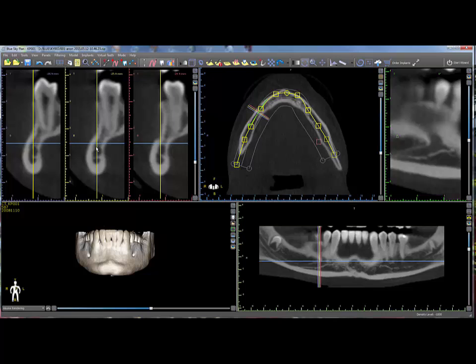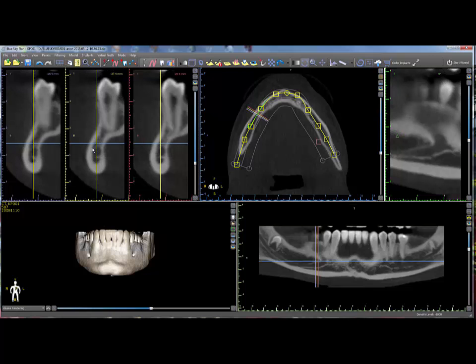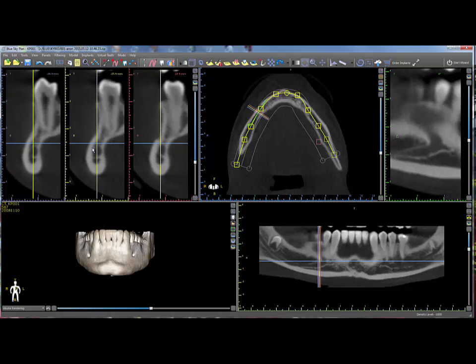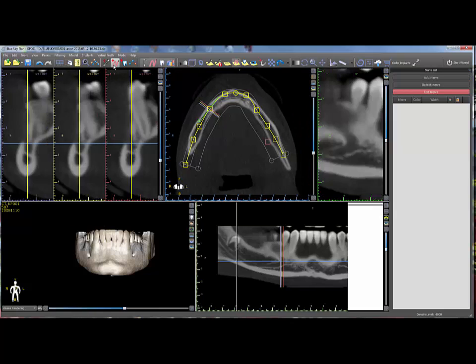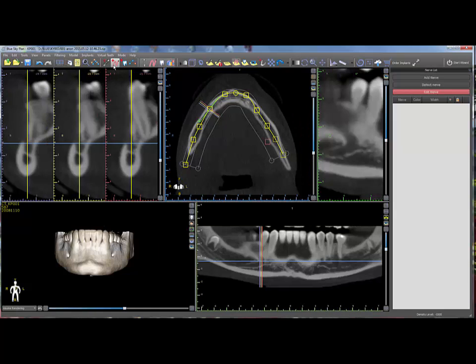The first step in marking the nerve is to identify the mental foramen in the cross section slice in the top left. Click on the add nerve icon in order to open up the nerve panel.